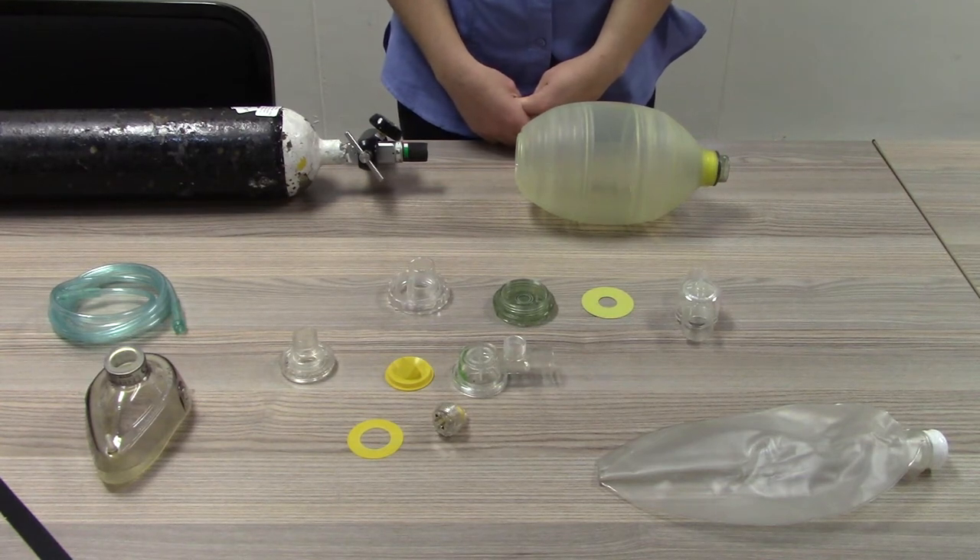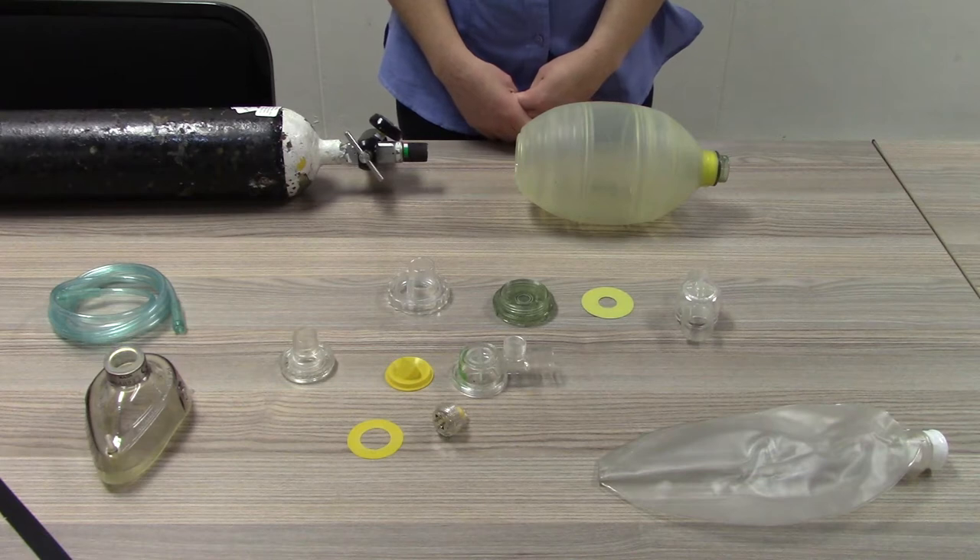Assembly of bag valve mask reservoir device. Step 1: Preparation. Select the required components to assemble the BVMR device.